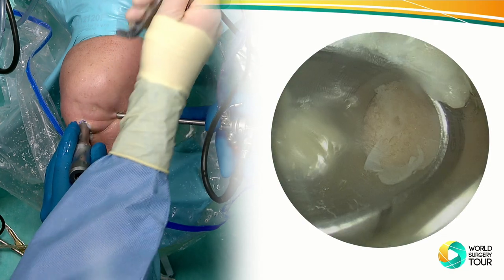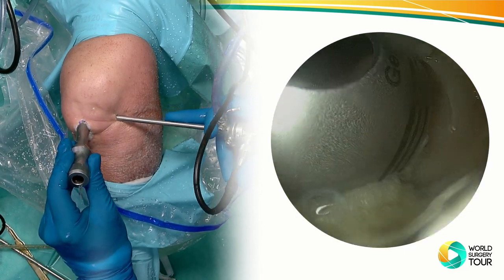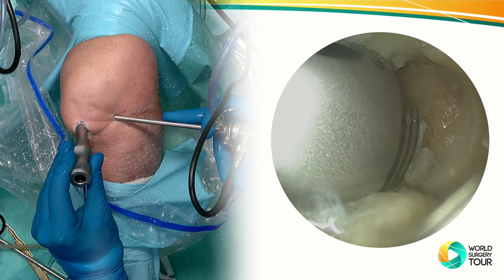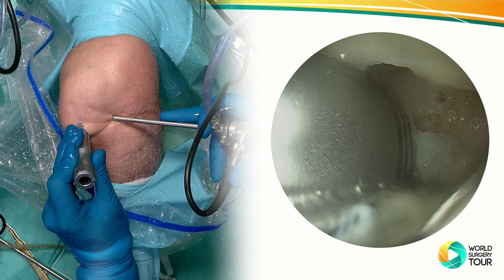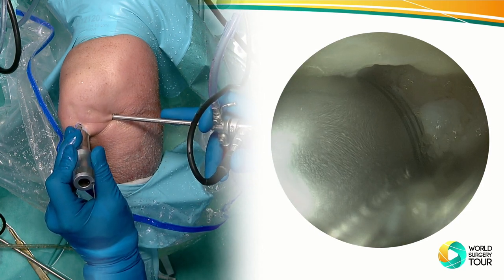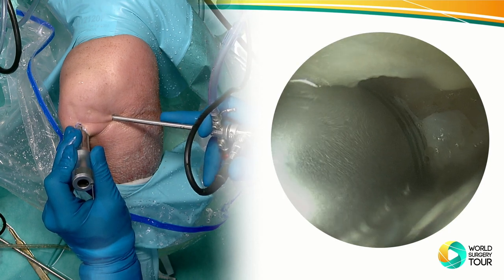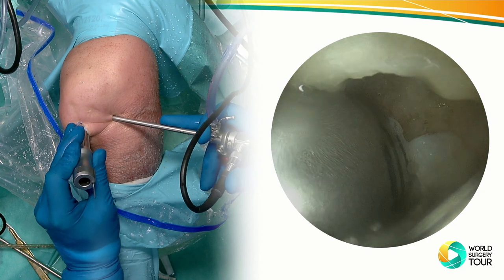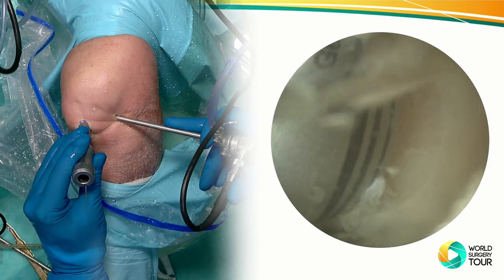Okay. And now you have, I don't know if you can see it on the view, I can lift up the cannula a little bit, and now I can tilt it without losing my position to any other direction, punch it in again, and therefore I can now match the geometry of my harvest to the geometry of the defect. So it's like a snowman technique, like we know it from the Oates procedure.